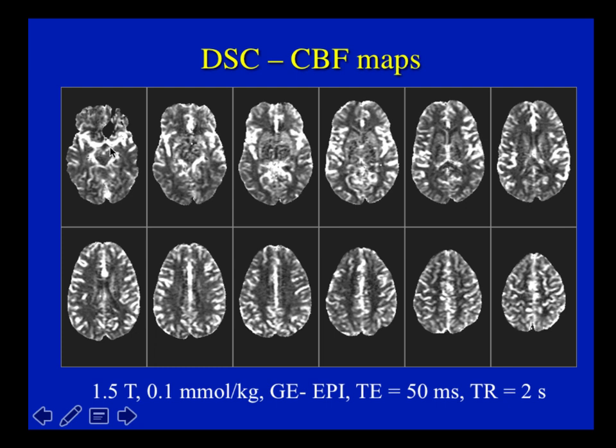And here I would also like to point out that there is very high blood flow or signal in the CBF maps where the arteries are, in this case the middle cerebral artery. When you look at these maps, you have to be careful that if you are looking for pathologies close to large blood vessels, you don't miss them.